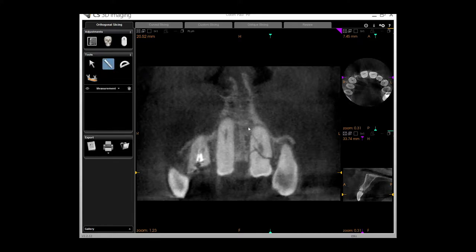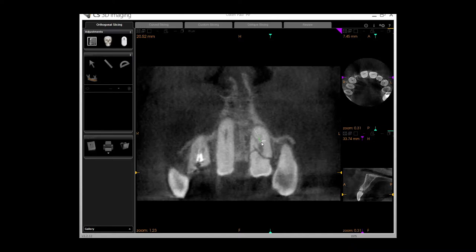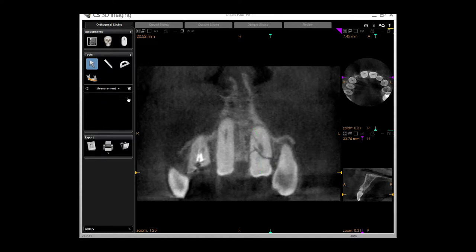I can provide measurements using the ruler as in most scans. Just double-click and go over to the delete button on the right side beside the measurement if I want to remove it from the screen. Same with angles — I can measure the angle and delete it when finished. I can also plot inferior dental canals using the icon on the left in the lower scan.